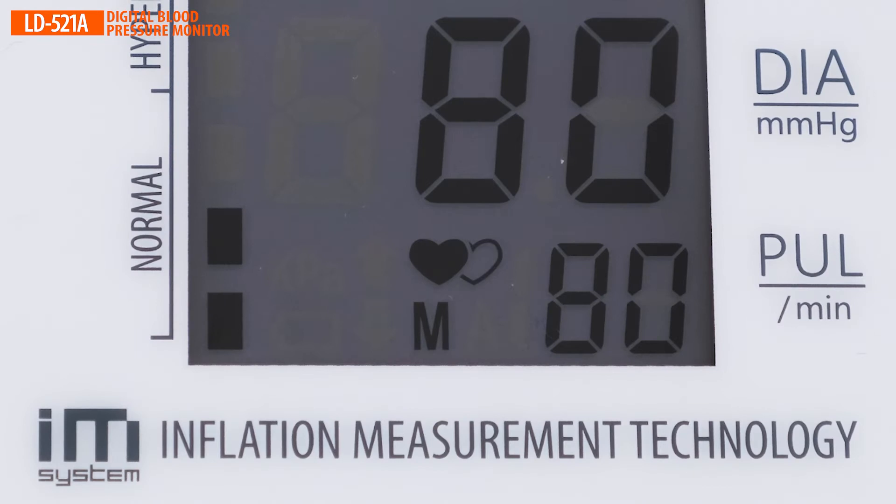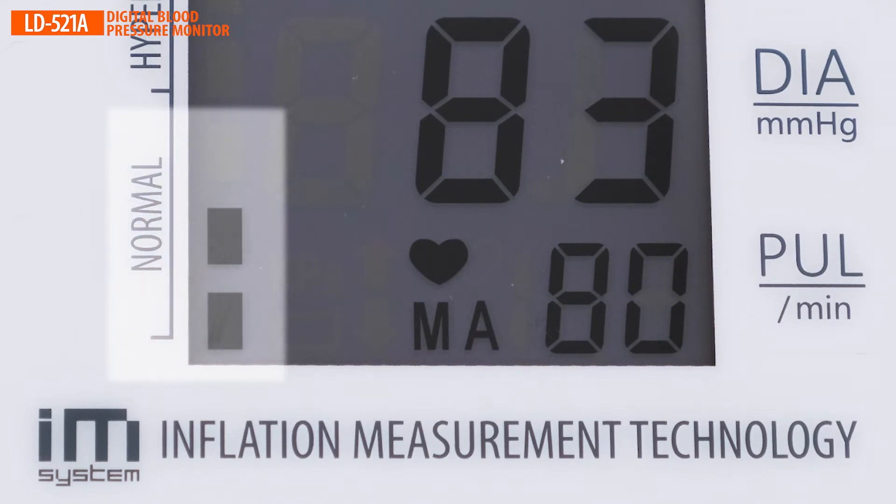The hypertension indicator is an auxiliary function for visual assessment of the measurements according to the WHO blood pressure classification.